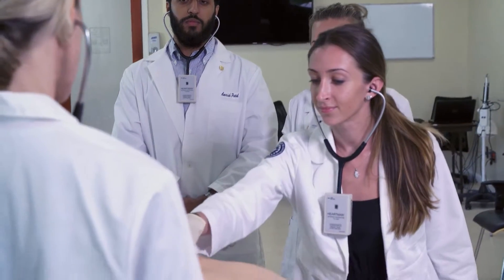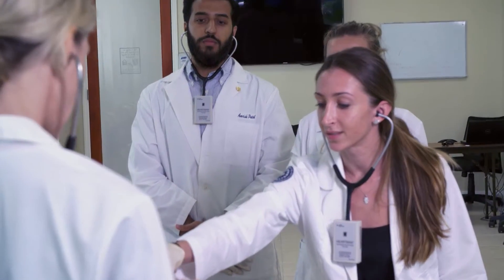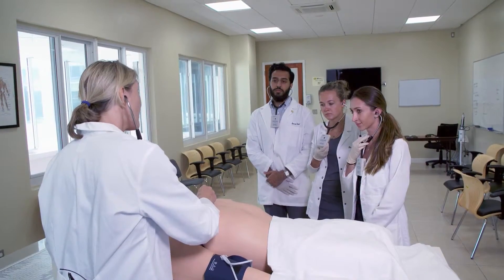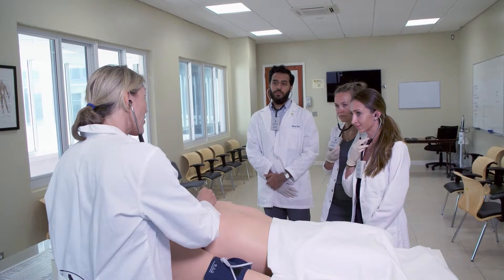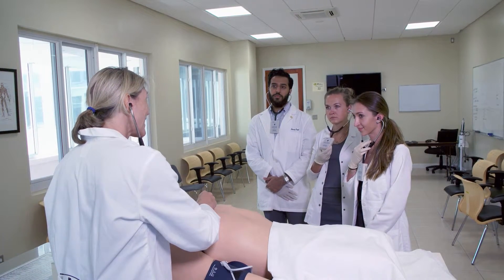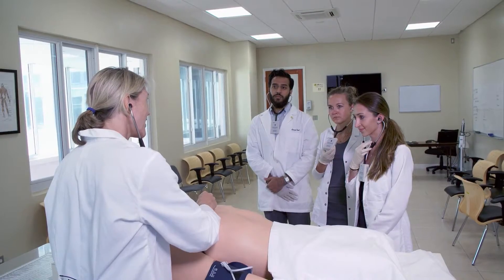Come and show me where I would hear the aortic area first. Where would the aortic area be? Can you remember? Now the first thing you might notice about that — can you hear the second heart sound?